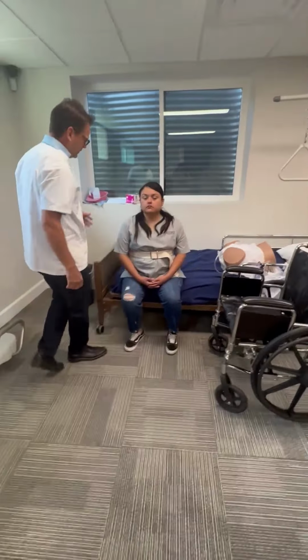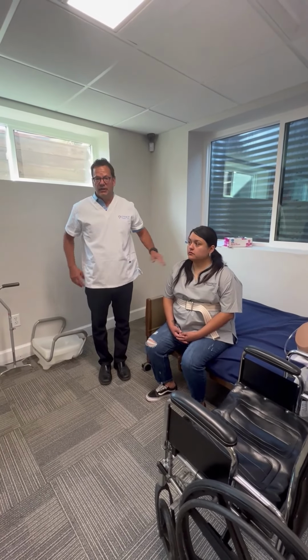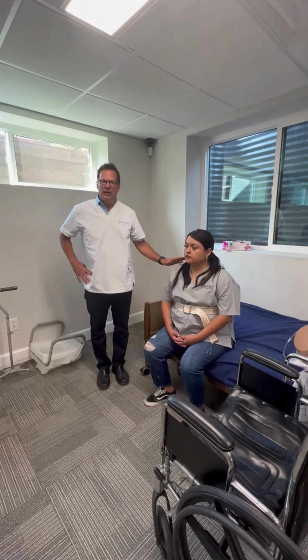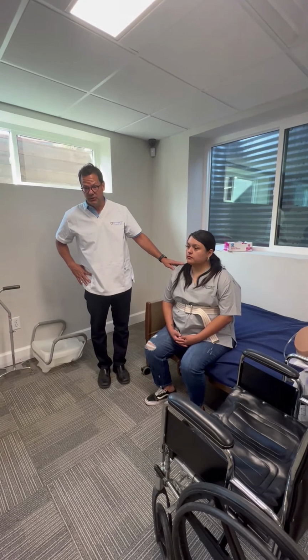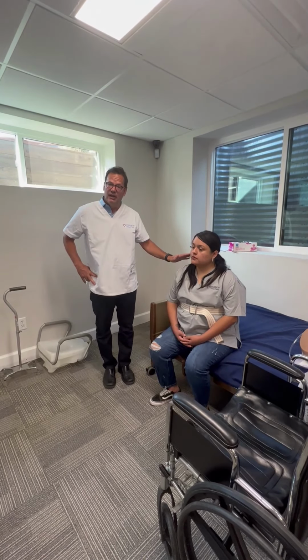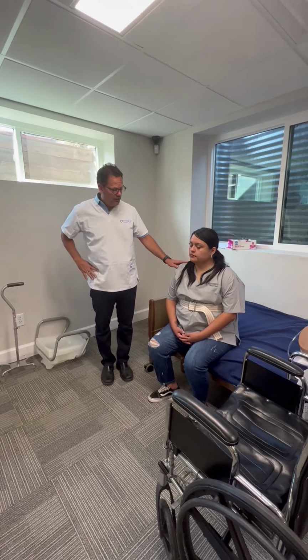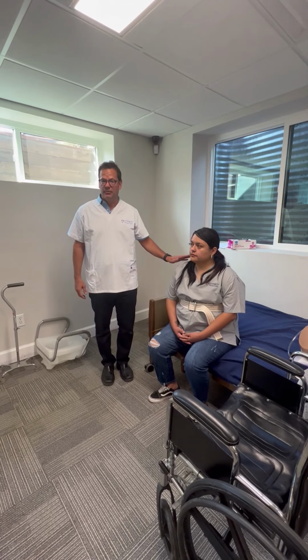So for the first transfer that I'm going to do, let me just speak to this. It is very important to give our clients very simple instructions. In this case we have the belt already on, and one of the mistakes that we make is we might not give specific instructions. We might say, I'm going to transfer you to this chair. That would be a mistake. A simple instruction would be, on 3, I'm going to have you stand up. That is something that's going to connect with them. They know what their first step is. After we take that first step, we'll give them another instruction, but that is very important.